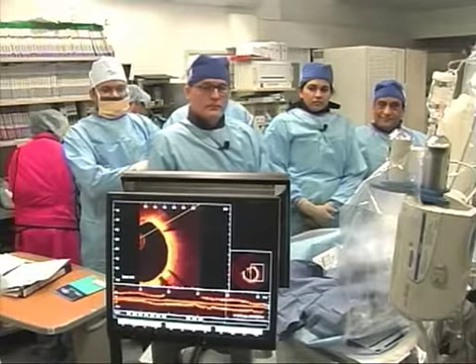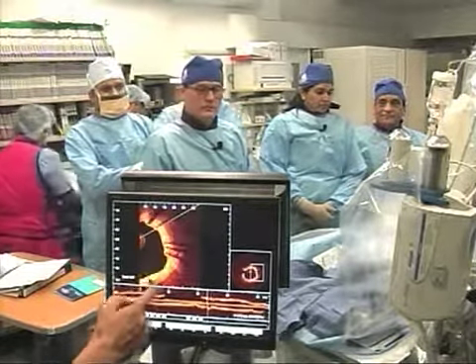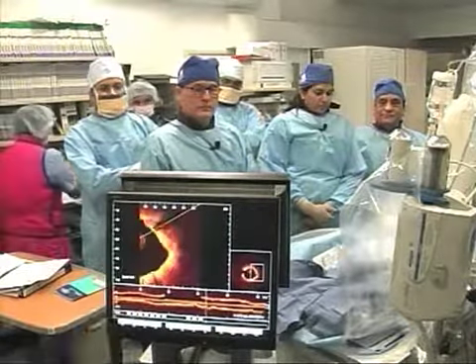Anu, excellent demonstration. Hopefully, there have been many lessons our viewers would have picked up on how to treat a genuinely complex case with severe calcification, bifurcation. Hopefully the findings for the OCT as well as some didactic points have been useful. We conclude this session today.